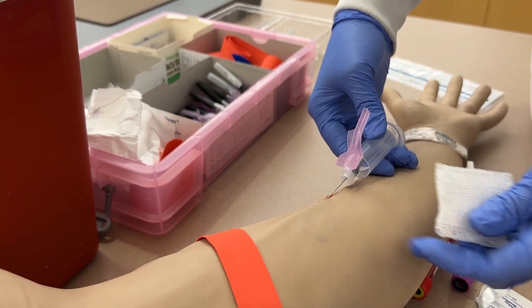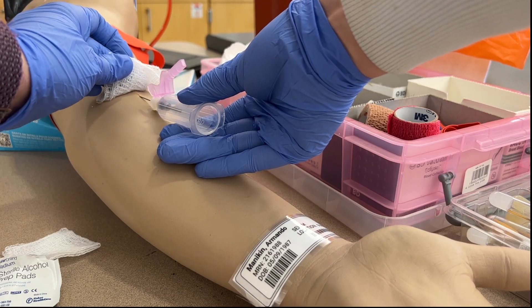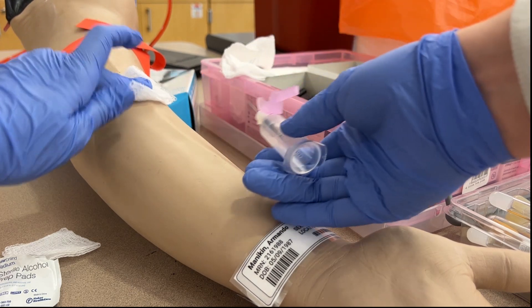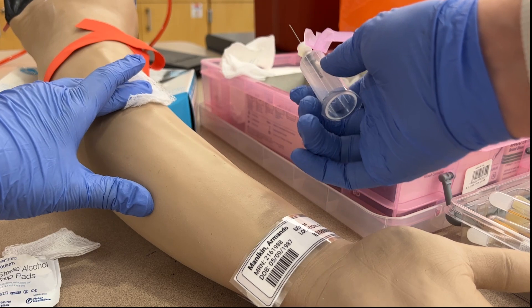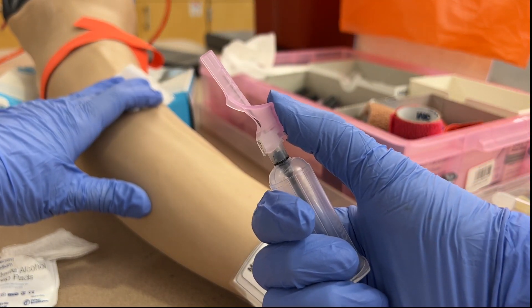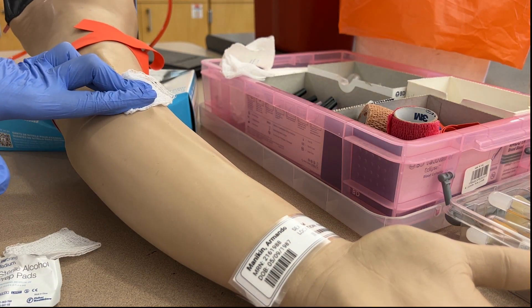Next, grab a clean piece of gauze — after ensuring the tourniquet is no longer on the patient's arm — and place the gauze gently over the insertion site. Quickly pull the needle out, apply pressure with your non-dominant hand, activate the safety shield using your thumb, and then dispose of the needle into the sharps container.